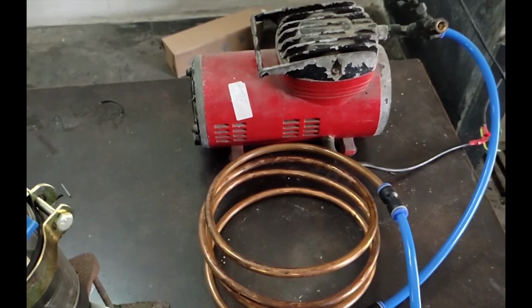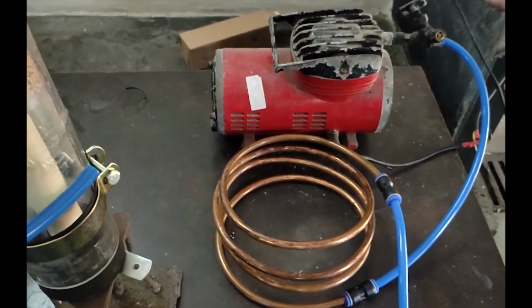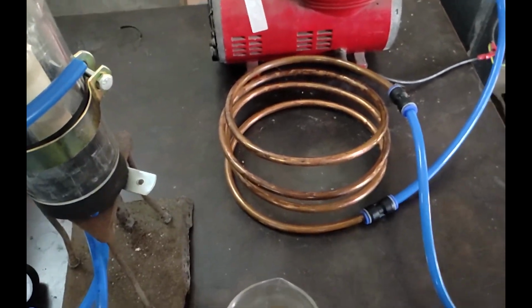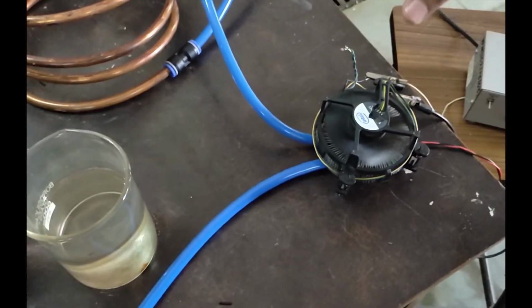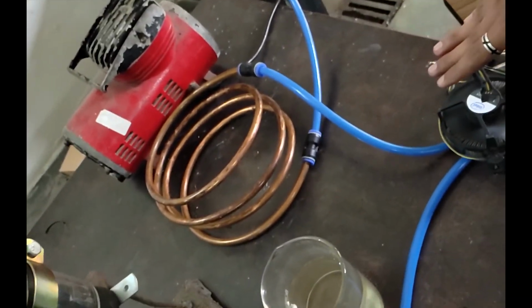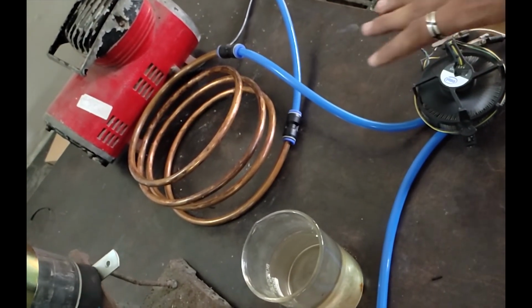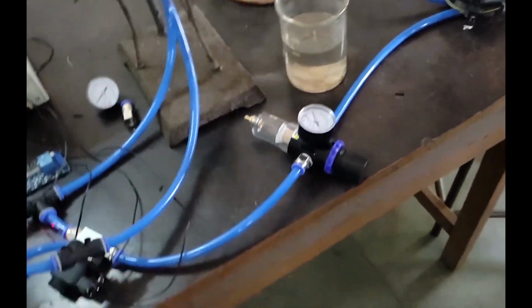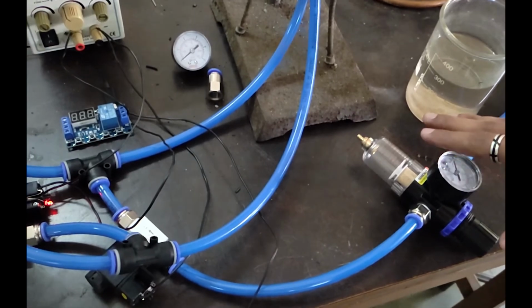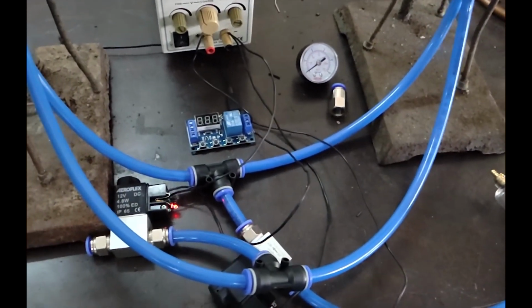Hello guys, so here is the actual working of the system. At the initial stage, the air is supplied through the compressor to the helical coil, and after that the air is supplied to the Peltier module. Both of these, the helical coil and the Peltier module, act as heat exchangers, and the cooling of the air is done in both of them. After that, the air is passed to the air pressure regulator as well as the moisture trap, and the air is then supplied to the columns.